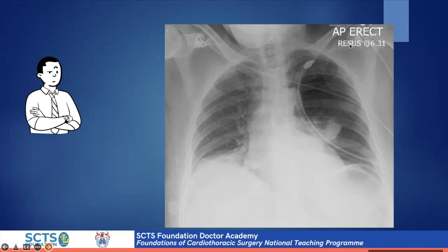And the patient is obviously very unwell, had a chest x-ray in resus. It's an AP erect view. That's why I put that one up, just because it's a very abnormal chest x-ray, and important just to check about the drain placement. When we're looking at drain placements and commenting on them, we want to see that the chest tubing is secured well inside the chest. Is the drain placed basally or is it placed apically? Obviously, if there's air, it's best to place the drain apically. If it's fluid, meaning blood or effusion, it's best to place the drain basally, because of gravity.